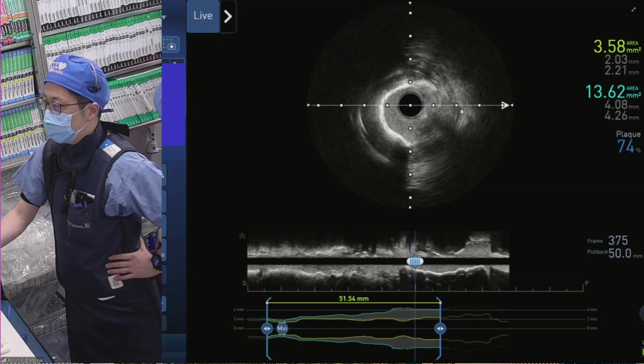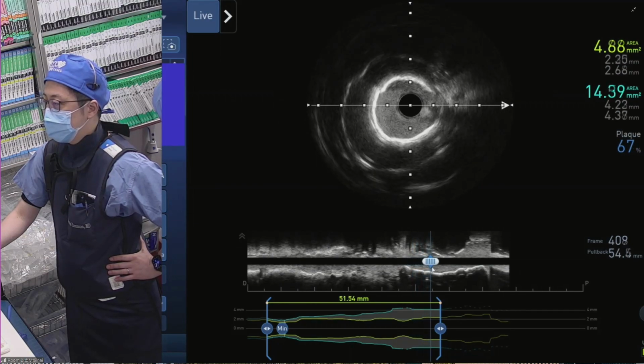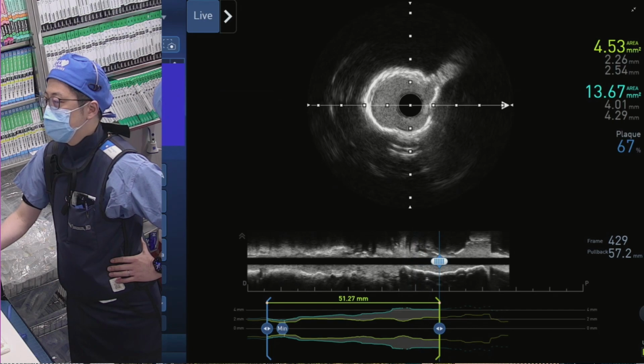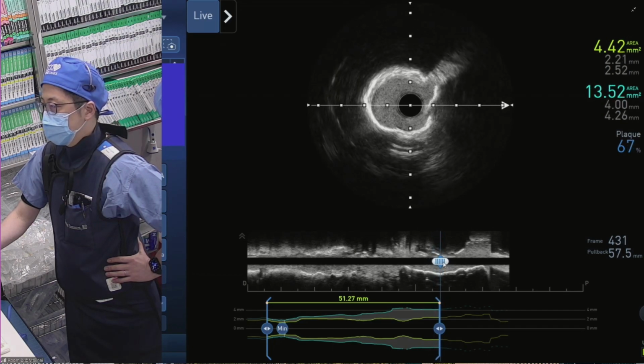It looks like some hematoma here. So come proximally, more. Yep. Oh, yeah, right there. I mean, it might be our landing zone. Yeah, you look at that 4 o'clock. It's a break in the calcium. I think you've broken it enough to be stentable, to go.